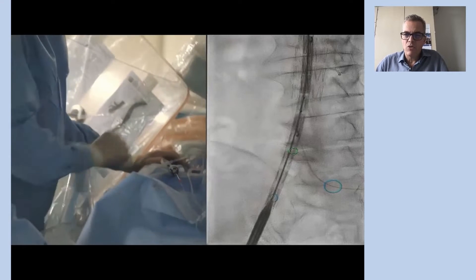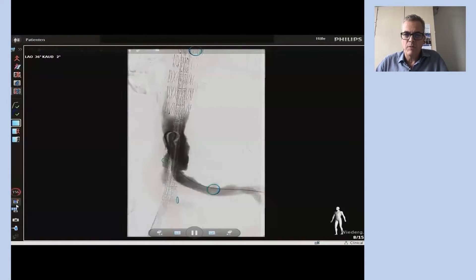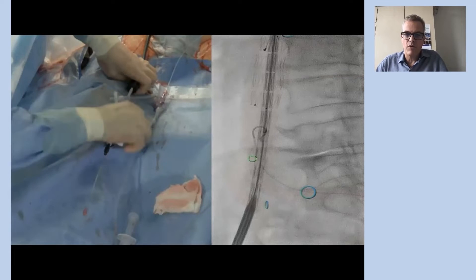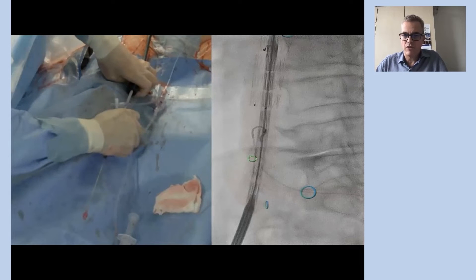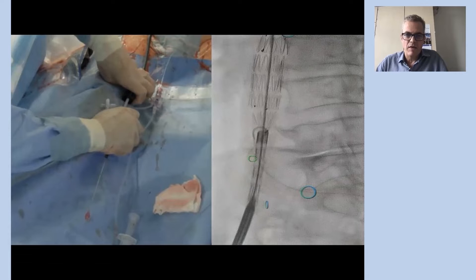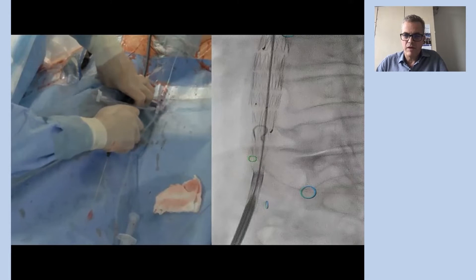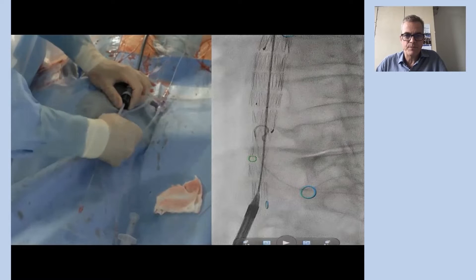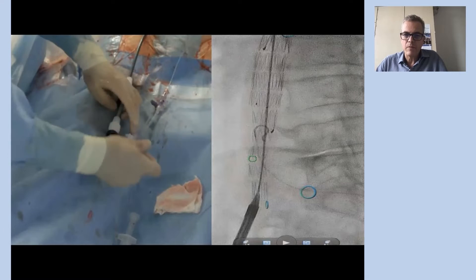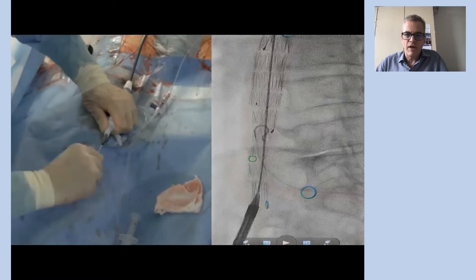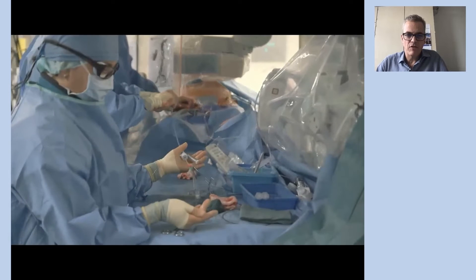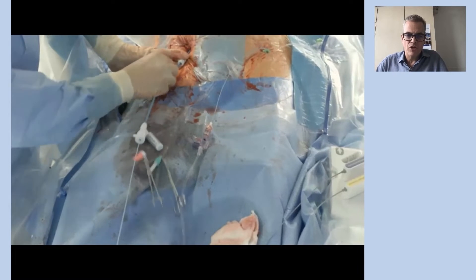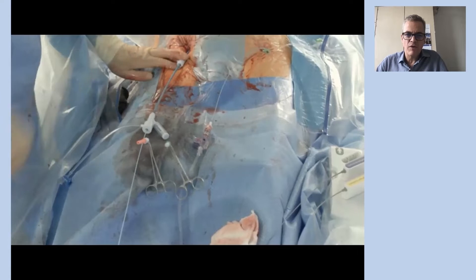The biiliac component is also deployed here, as you can see, using the marker for the hypogastric artery on the right side for the length and the position of the deployment.